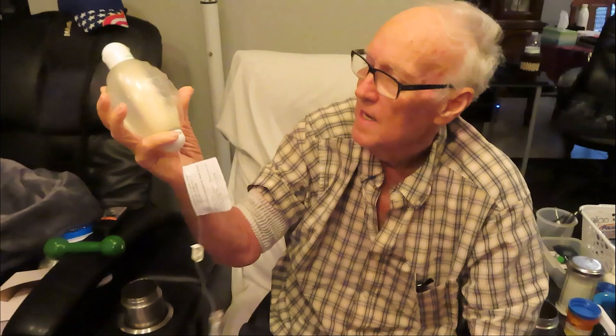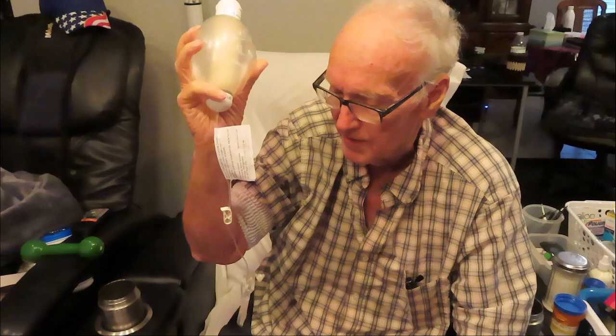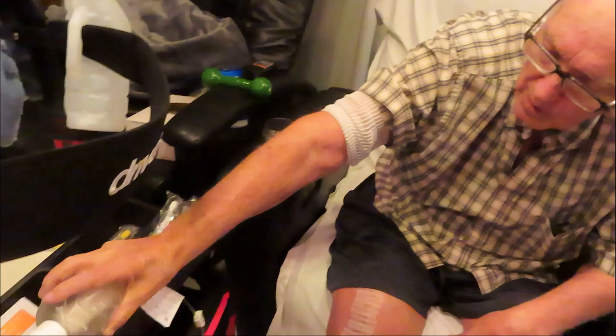I've never seen one of these before, an IV. The only ones I ever seen you hang up. This you just pull out of the refrigerator, let it warm up, and then hook it up and it does its thing for you. So that's how this is made, which we got to do in just a minute.